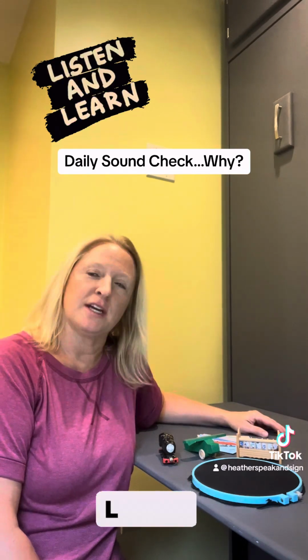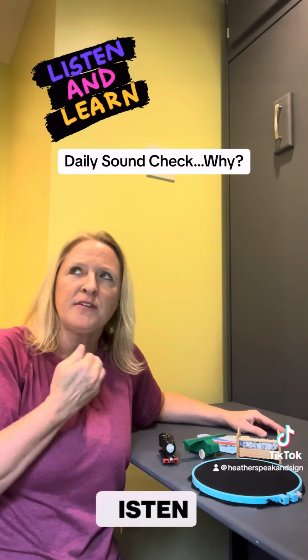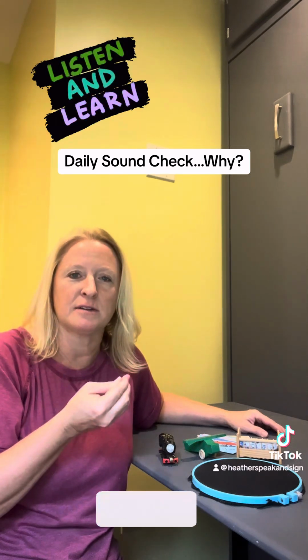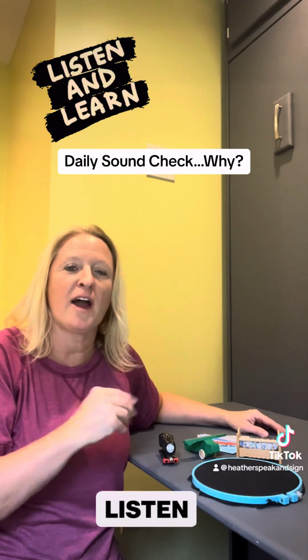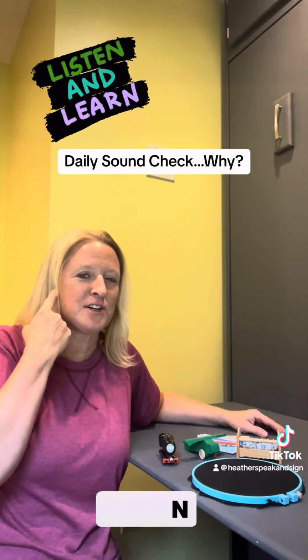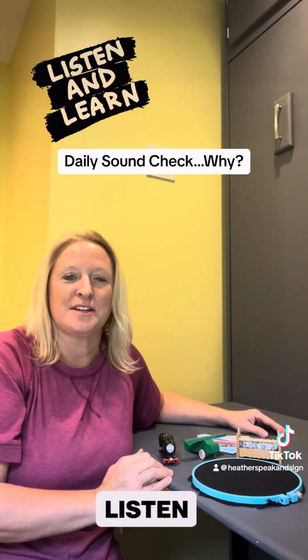If we have a new kid who's new to hearing, recently implanted, just got their hearing aids, we're doing it for kind of a different reason. We're doing it to help teach those early auditory listening skills: detection, discrimination, identification. We'll have another post on all that. We're actually teaching them to listen and to use that auditory channel to the best of their ability. So we want to really teach them those skills and that foundation.